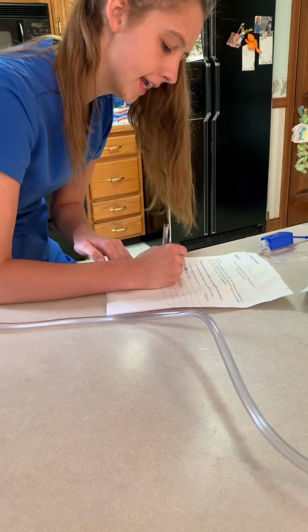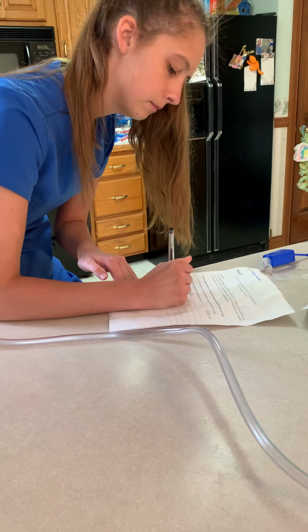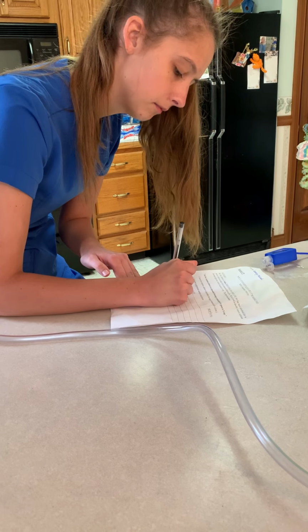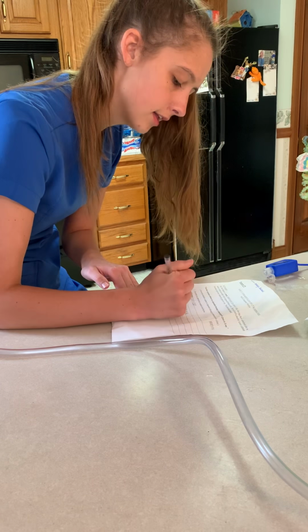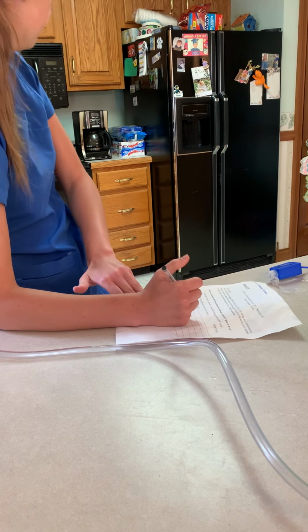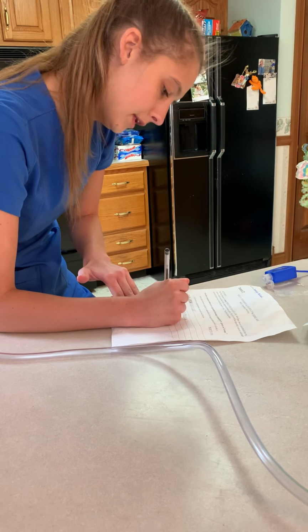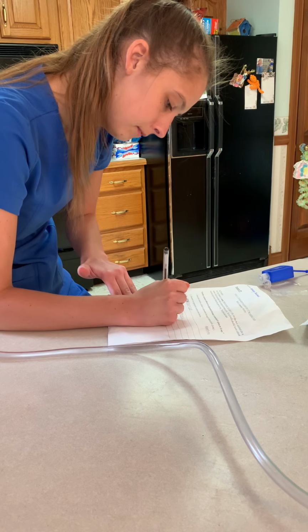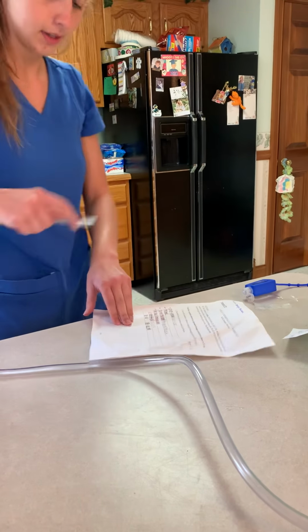Okay, and then I'm going to date it. And I'm going to put the time down. I'm going to initial. Okay, and I'm now going to show my documentation, and that's it.